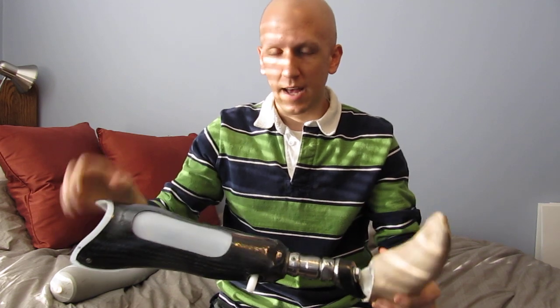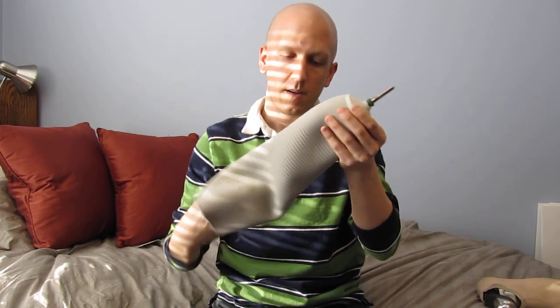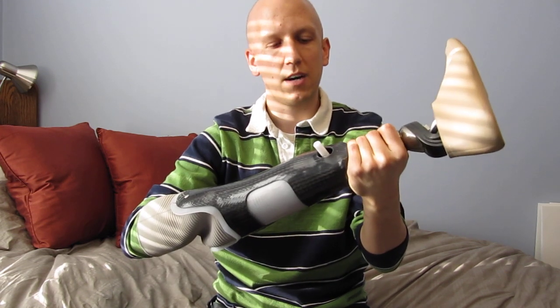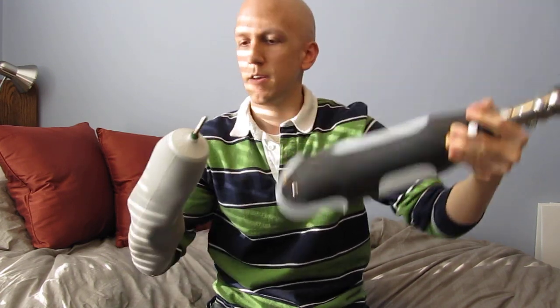The prosthetic is attached to my leg with a pin kind of like this one. The pin screws into a liner, and then the liner goes around my leg. You see those teeth on the bottom of the pin? Those ratchet into the mechanism at the bottom of the prosthetic. Push it in — listen for the clicks. Nine clicks means it's all the way in. Then to release, just press the button and pull, and it comes right out.